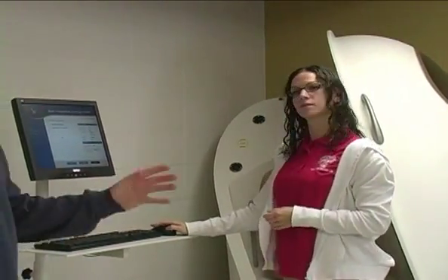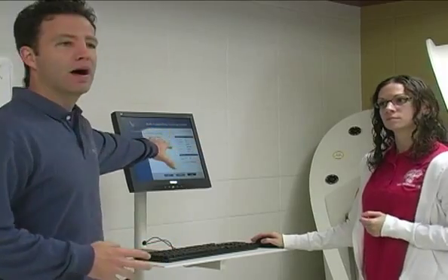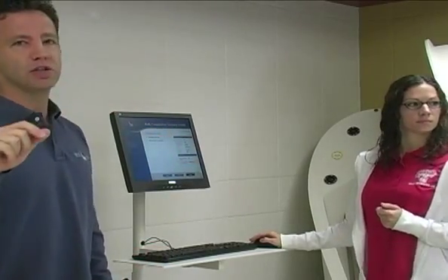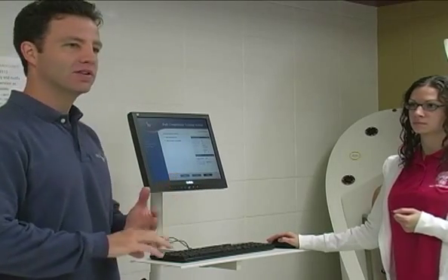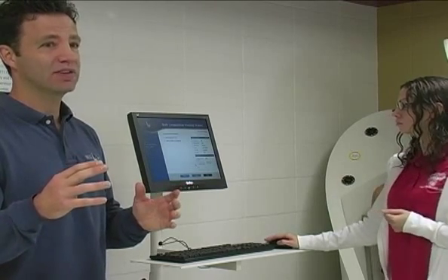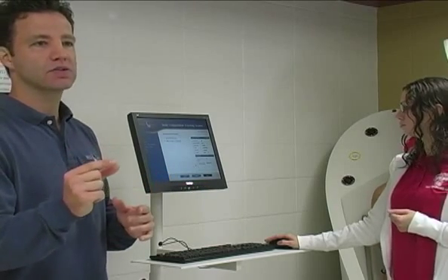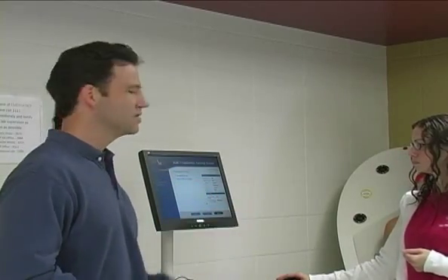Okay. Now we're gonna open the door. And you will perform 2 or 3 volume measurements. So this will be the second one. Why you would perform 3? The BOD pod will prompt you. It will say the first 2 volume measurements were inconsistent. We haven't seen that yet because when we did Brittany's, hers were consistent. If it does arise, it's because those 2 volume measurements weren't within 0.2% of one another, which is only about 150 milliliters. And that's incredible as far as our specs. So if it falls outside of that, if measurement A was 190 milliliters different from measurement B, then it would prompt you, saying inconsistent. Why you would see that is some people shake their leg in there.